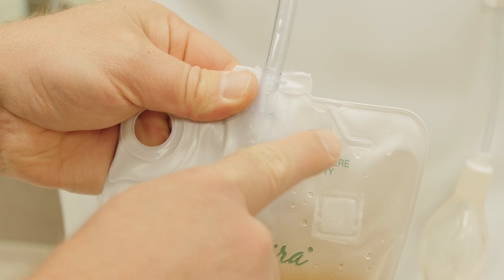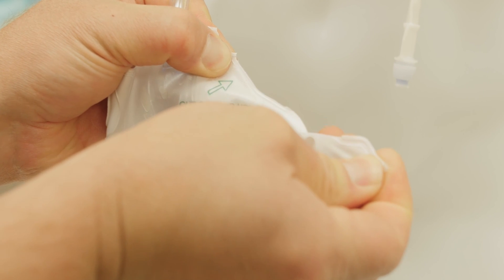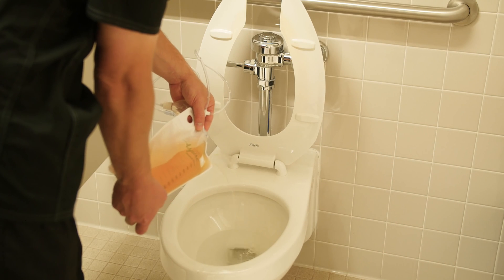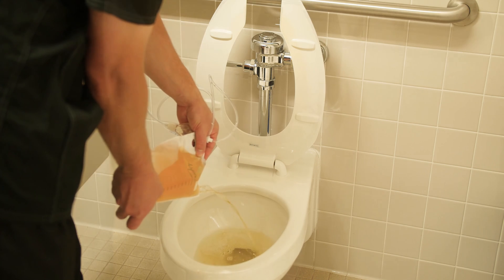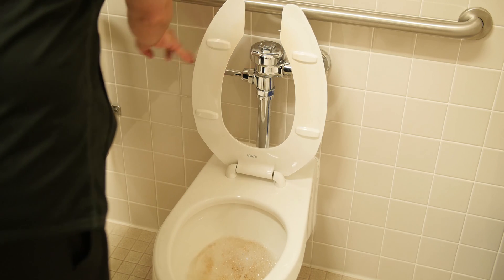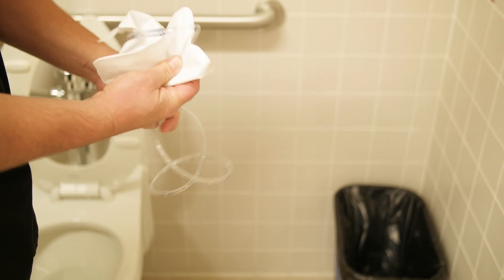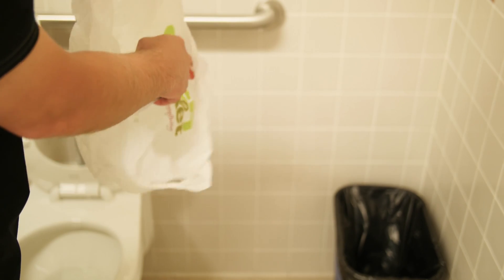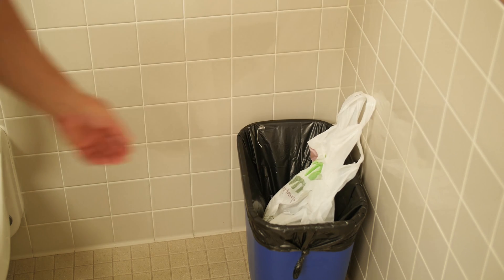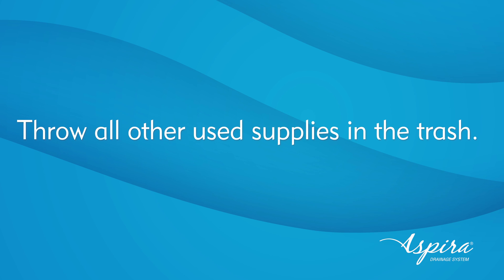By tearing or using scissors, cut the corner of the drainage bag where the 'tear here to empty' arrow is pointing. Empty the fluid into the toilet or sink. Flush the toilet or fully rinse the sink. Coil the drainage line around the empty drainage bag. Place it in a small plastic trash bag and throw it away. It is very important to never place the Aspera drainage bag in a recycling bin. Throw all other used supplies in the trash.